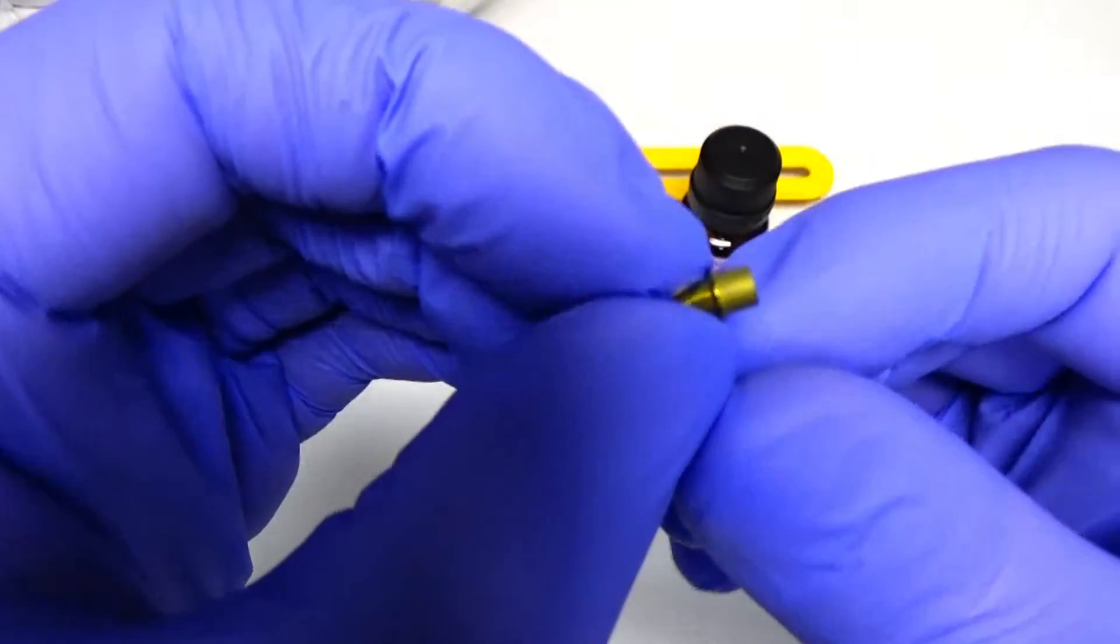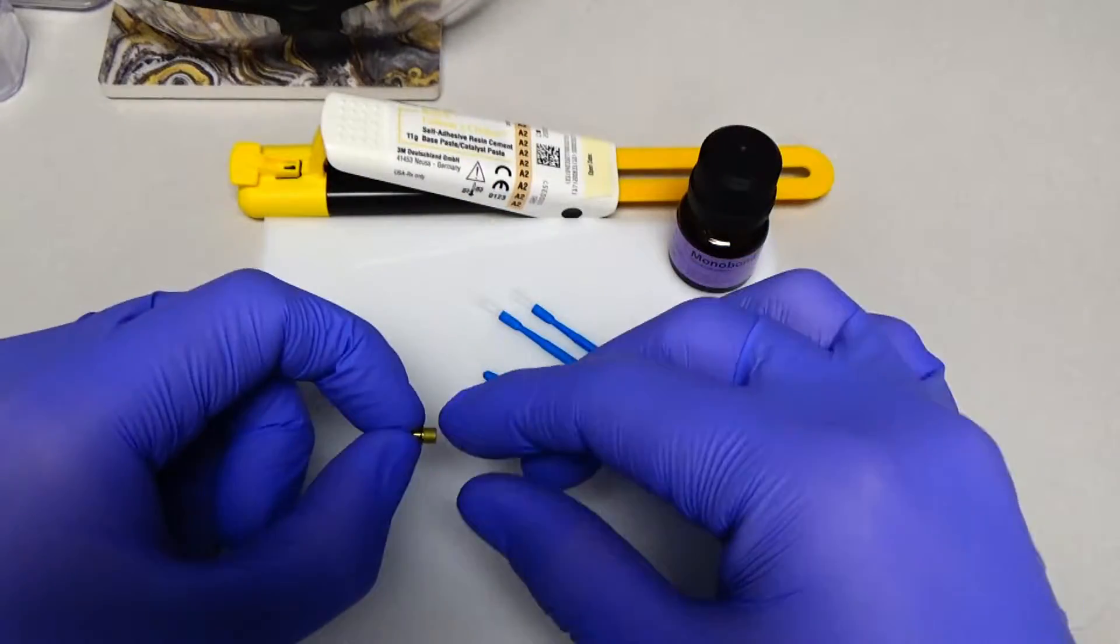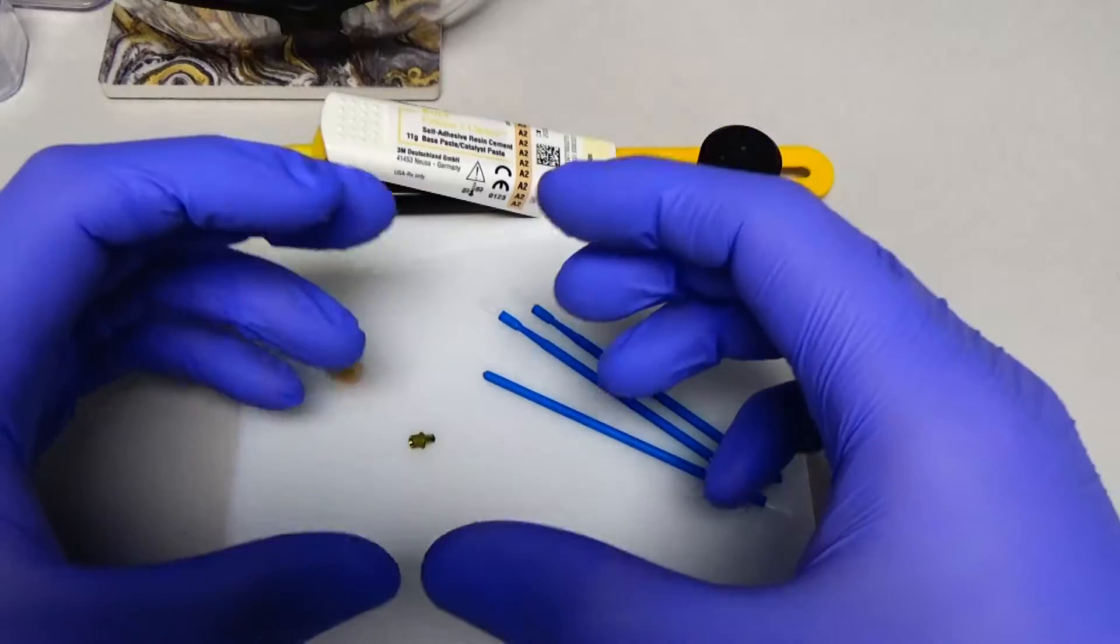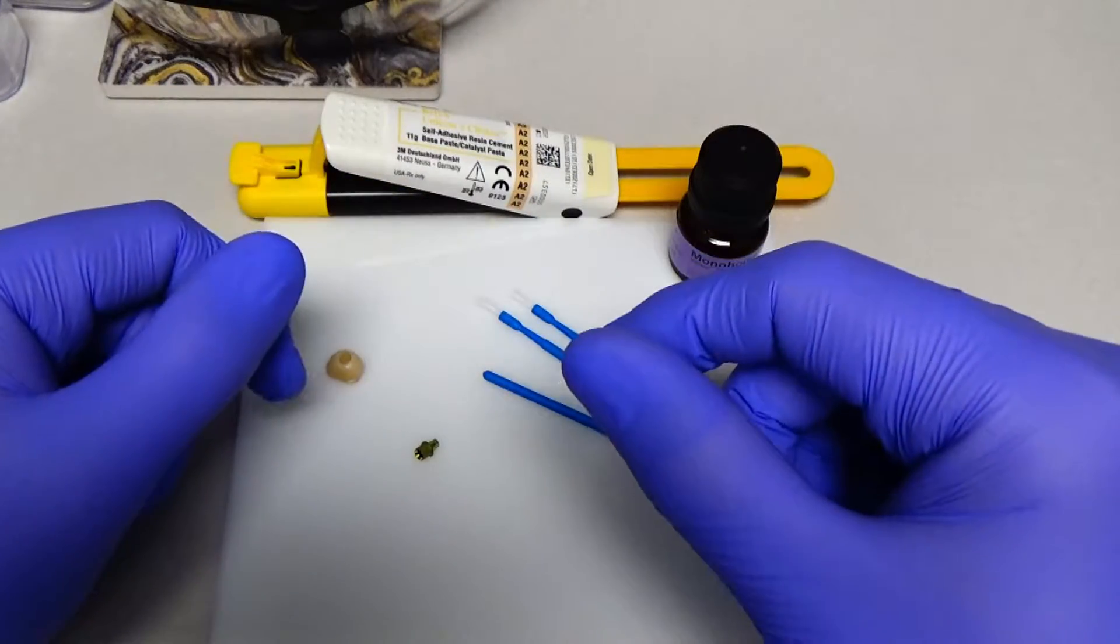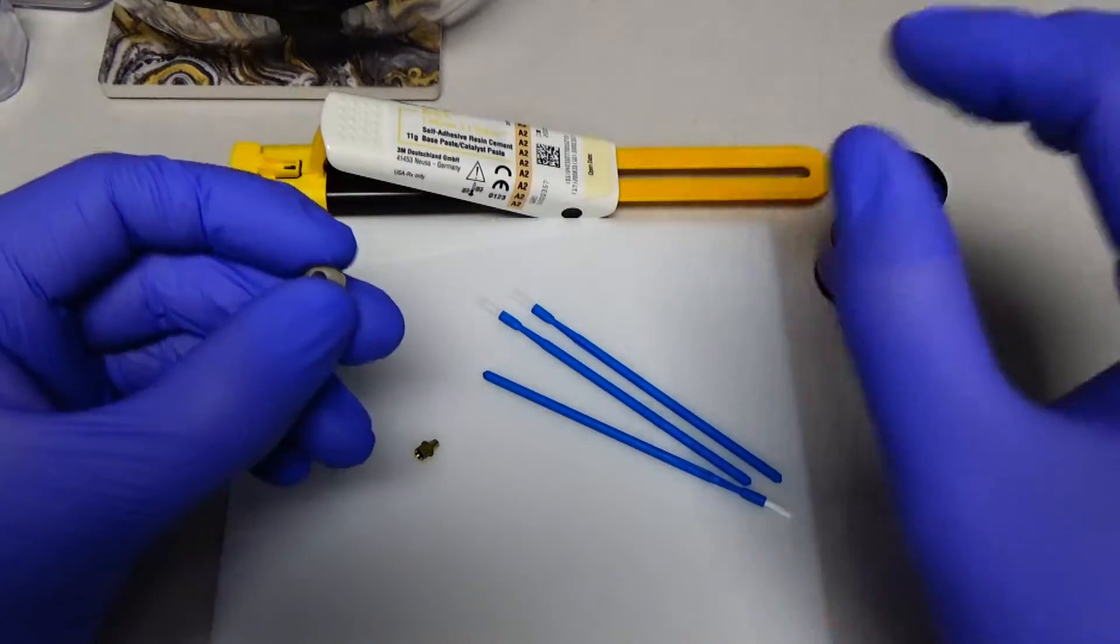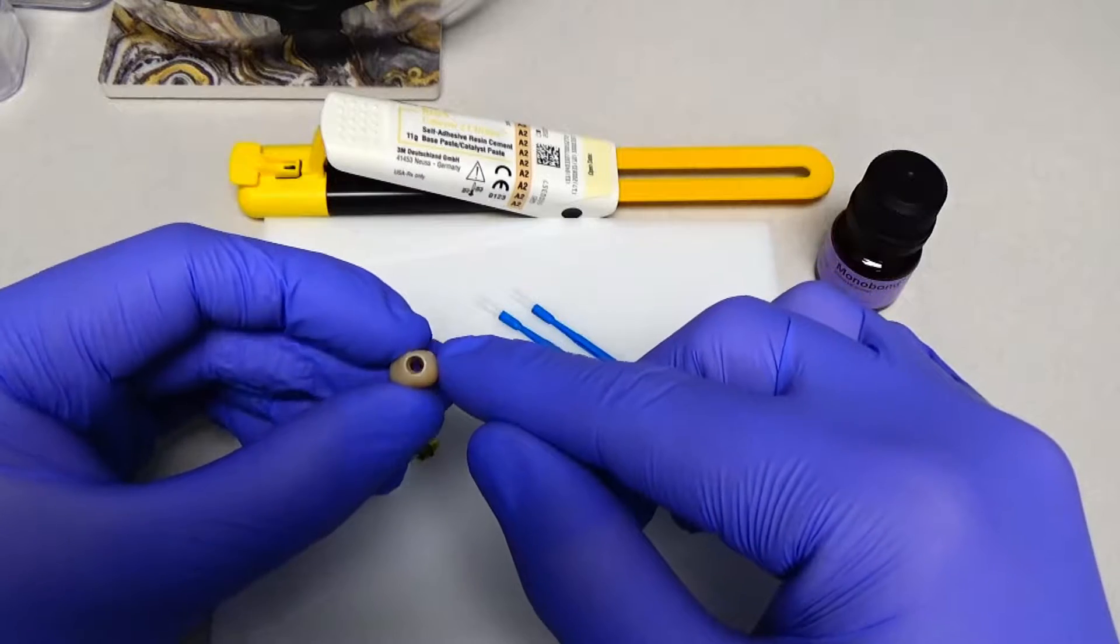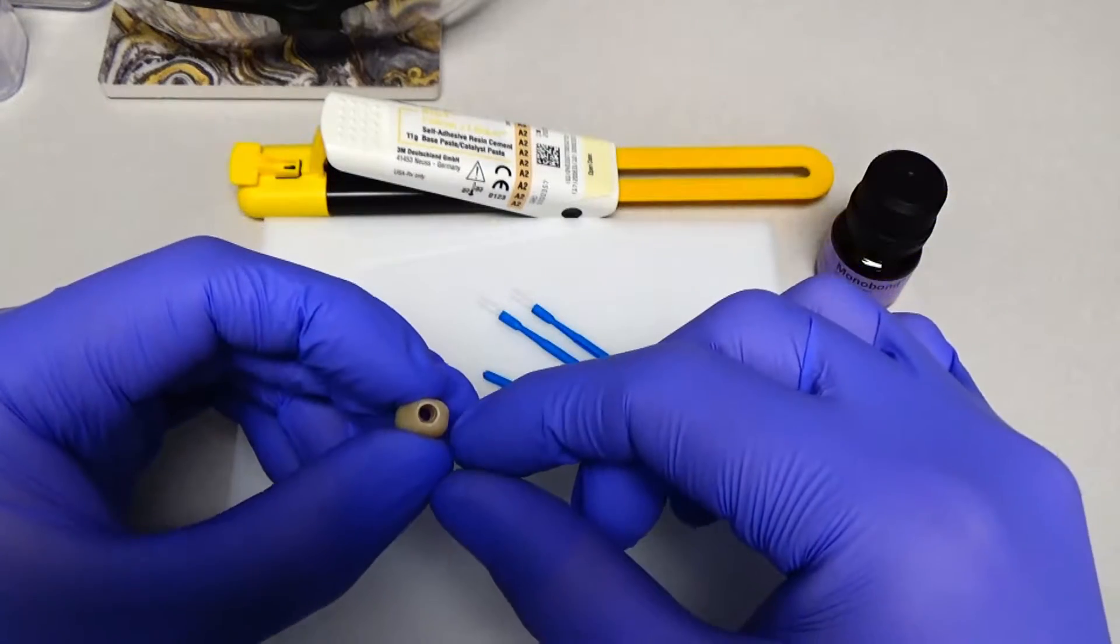And that's an important thing to keep in mind because whenever we want something to stick to something else, we need to think of it as far as etch, prime, and bond. In this case, the zirconia itself cannot be etched with acid, but it can be etched with air abrasion particles.